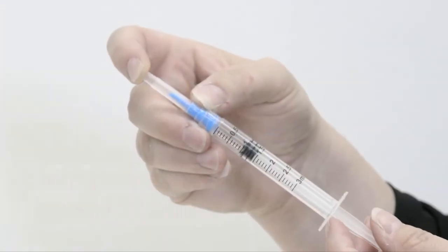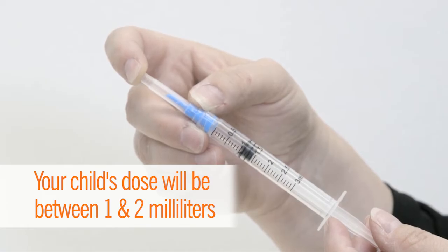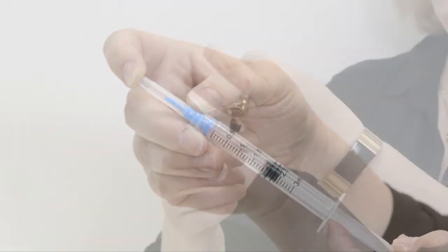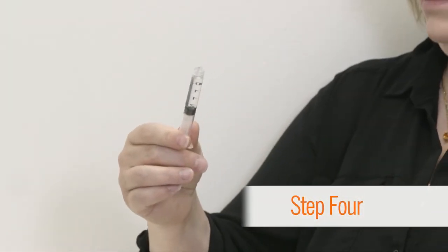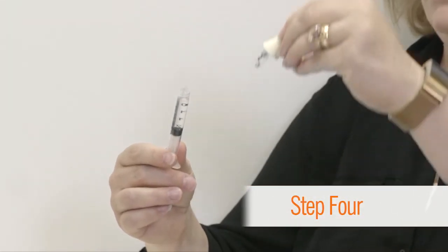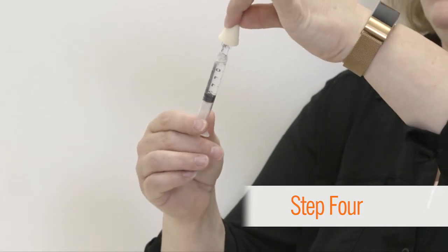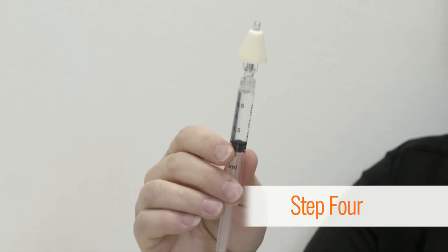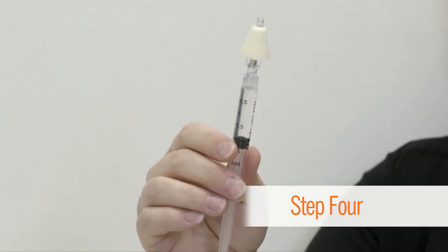Depending on your child's dose, you will have between one and two milliliters of medication. Remove the blunt tip needle from the syringe and place the atomizer on the syringe. Make sure the connection is secure so that no medication is lost at the connection site.